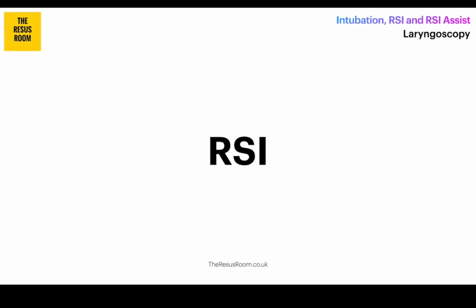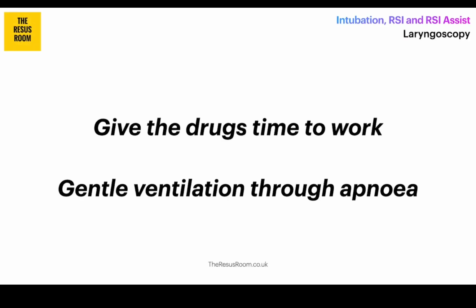Okay, so now we're happy with the process of intubation, both from a direct and video perspective. How do we add this into the mix of an RSI? Well, the good news is that there isn't a huge amount of difference, and it's just building upon what we've just been through and talked about to this point. Once the checklist is done, the main difference is going to be that we'll be putting drugs in and waiting for them to work before proceeding to intubation.